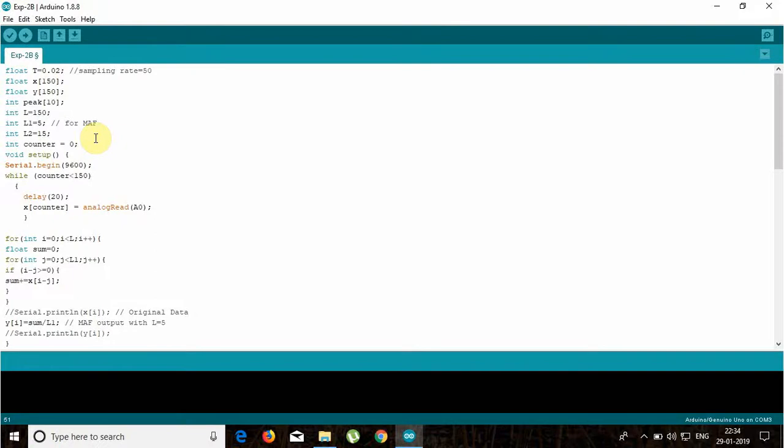Hi, this is a demonstration of the process of calculating heart rate with the help of real-time PPG signal data. Firstly, we create a variable t equal to 0.02. This is the time period of the original data. The sampling rate is equal to 50 Hz.